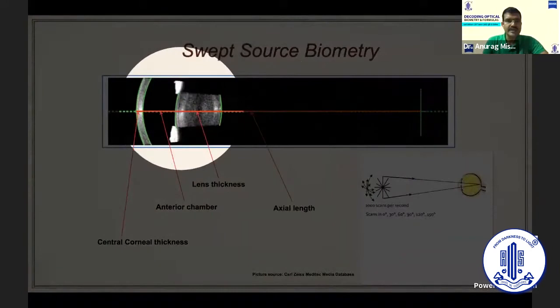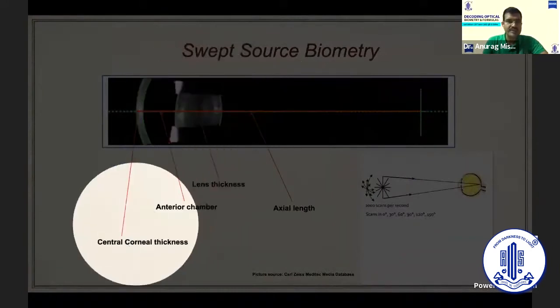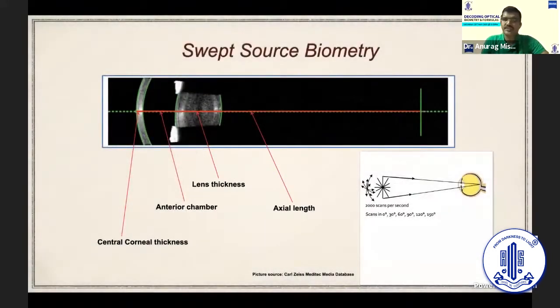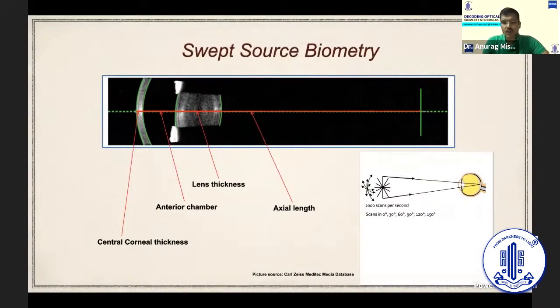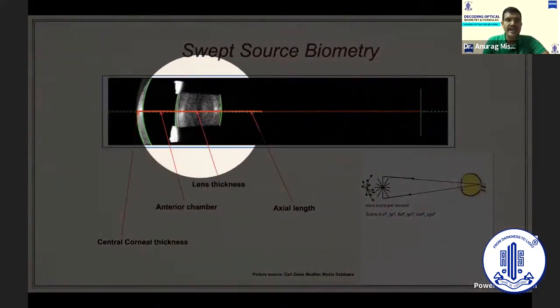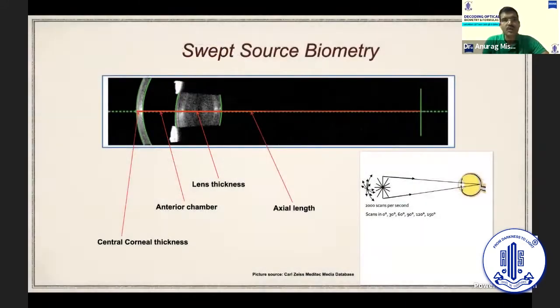So we can measure any distance, any point to any point to give us central corneal thickness, ACD, AQD, lens thickness, and axial length as well. The other thing it does is it also green marks the different semicircular contours like the anterior and the posterior lens capsules are also marked green. It has its clinical implications as you will see a little later.